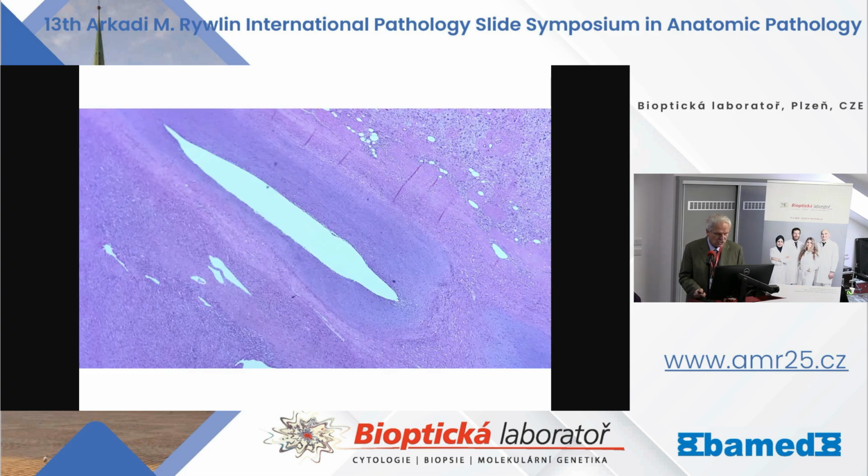And in histology, you can see just in this slide two different parts. In the lower part, there is a more diffuse spindle cell proliferation, and in the upper right part, there is a more pleomorphic area with vessels with collagen around the vessel.